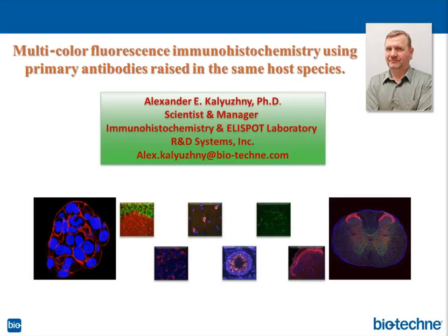And of course, when you decide to do the TSA stripping protocol, it may damage tissue pretty badly, and after the first round, you will not see tissue on the slide anymore. That's why this protocol, TSA stripping, is recommended for paraffin-embedded tissue sections rather than frozen.